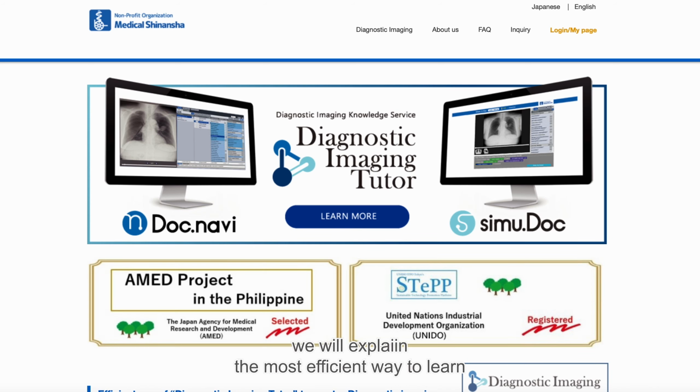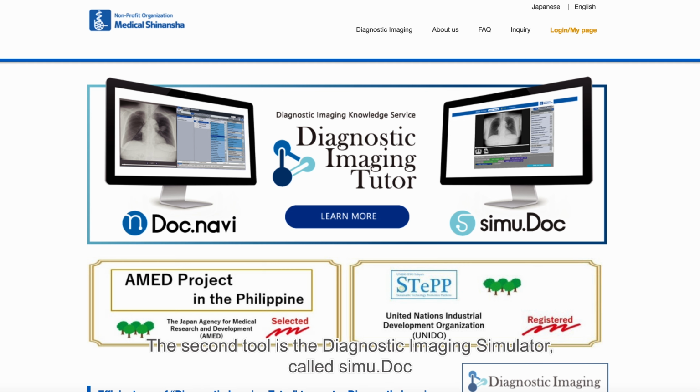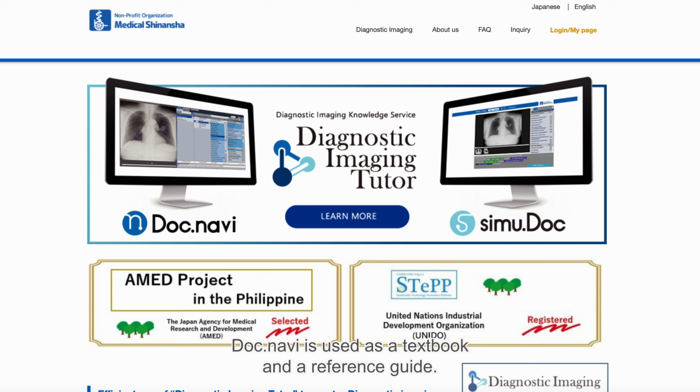In this video, we will explain the most efficient way to learn using the Diagnostic Imaging Tutor system. Before starting the study, everyone is required to watch this video. The Diagnostic Imaging Tutor system consists of two tools. The first tool is the Diagnostic Imaging Navigator, called Doc.navi. The second tool is the Diagnostic Imaging Simulator, called simu.Doc.